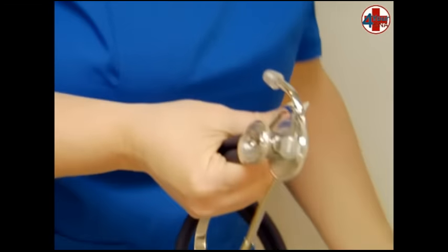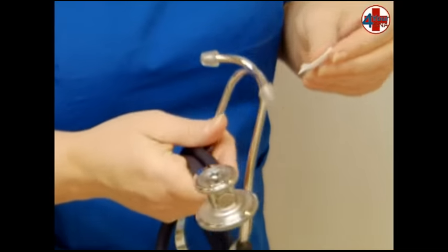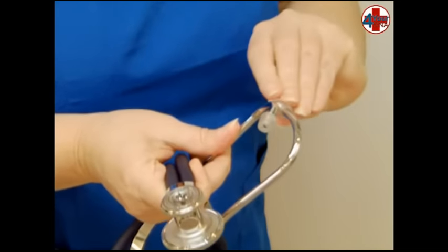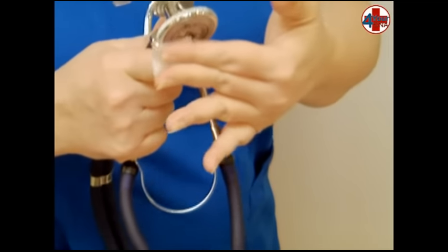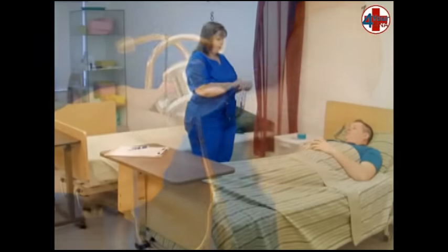Open the alcohol pad and clean each earpiece — yours and the evaluator's — and the large diaphragm on your stethoscope. Throw the alcohol pad away.